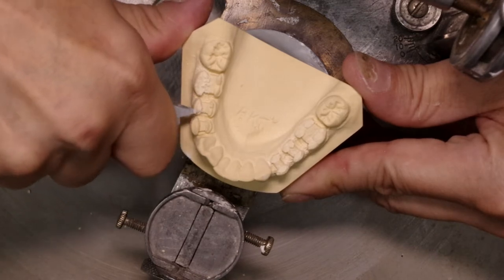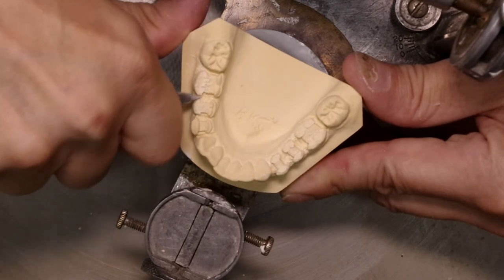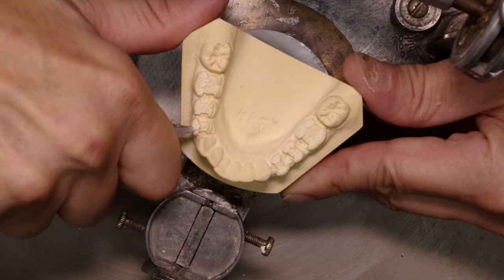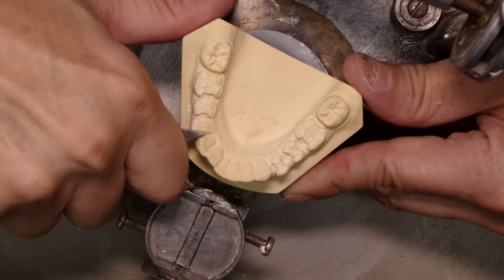Just be careful not to break the teeth, so do it kind of slow. If you want even more control, you can wet the model slightly so that you can get a cleaner surface.